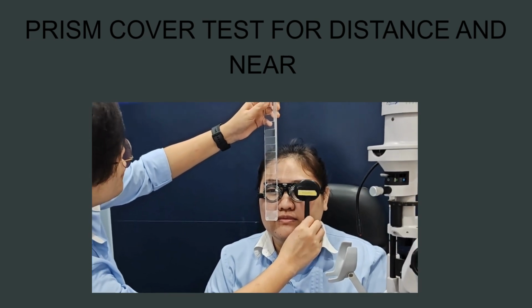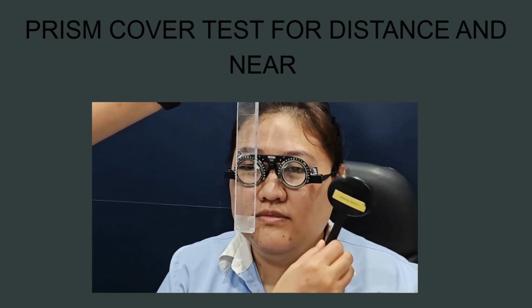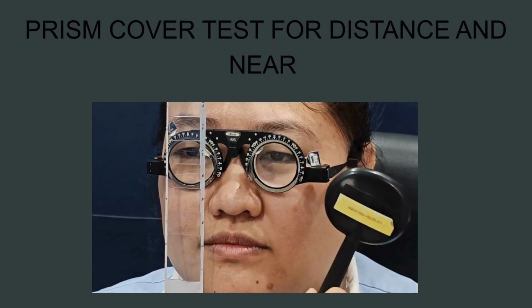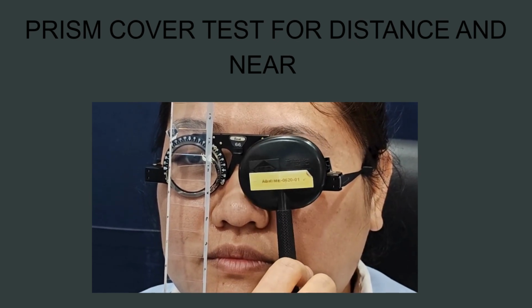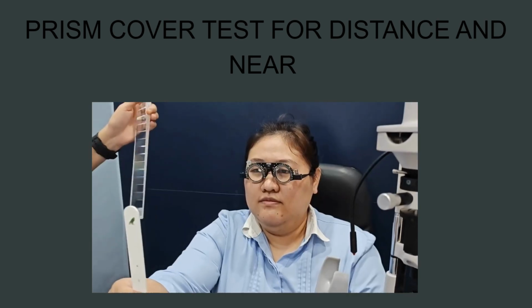1. Occlude one of the patient's eyes and put a prism of approximate strength over the deviating or non-fixating eye. Cover-uncover. Observe the movement of the eye. Fine-tune the prism strength until no movement is seen on uncovering the eye. Check alignment under the prism using the corneal light reflex.